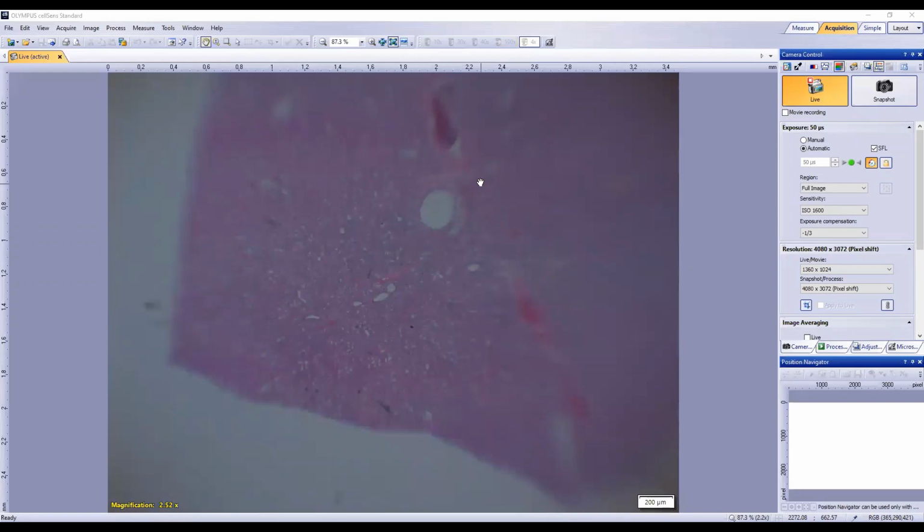The reason I'm asking is that as we go through the process, we're mentally constructing a description. What we're driving towards at the end is that first sentence, the overview of what's going on. Then as we get further through the description, we need specific details, and the convention is we give descriptors and then put our interpretation in brackets. So fibrin is our interpretation. What are our specific descriptors that we're looking for?